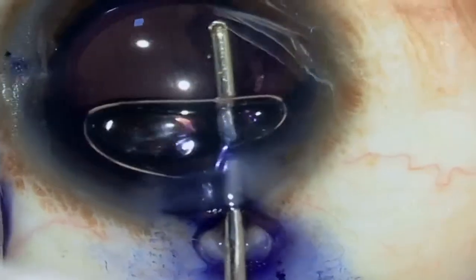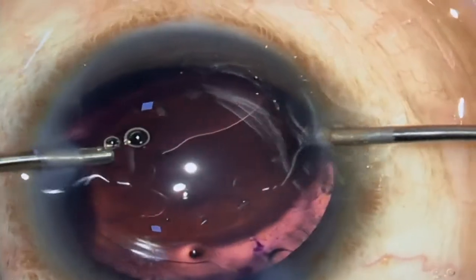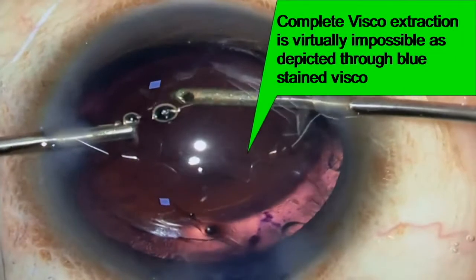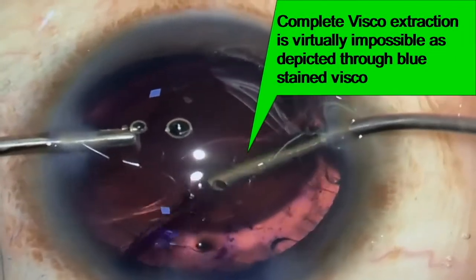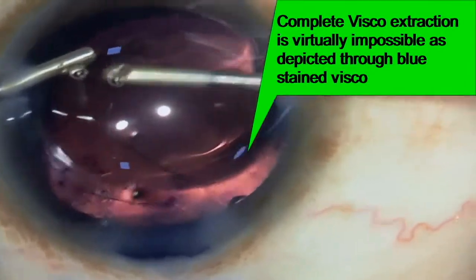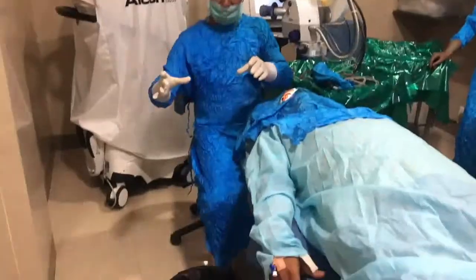Friends, let us see how difficult it is to remove viscoelastic completely at the end of the surgery. The blue flags seen here are retained visco. Now I am fully ready to say a big no to the sticky visco.